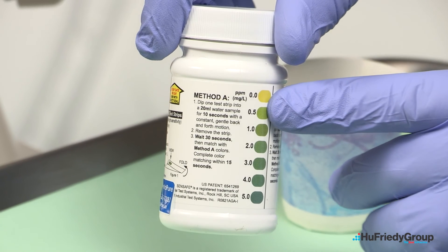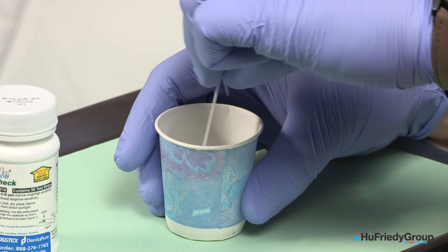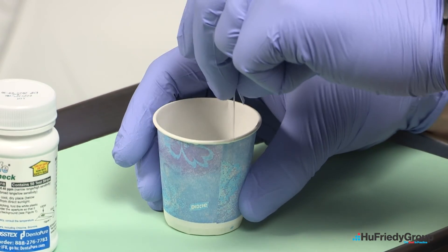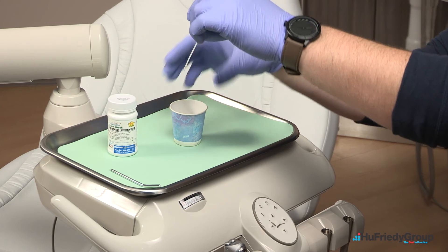Look for and follow method A on the bottle. Dip the test strip into the water sample for 10 seconds, using a constant gentle back and forth motion. Remove the strip from the water and wait 30 seconds.